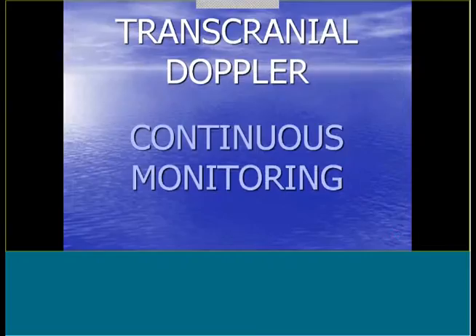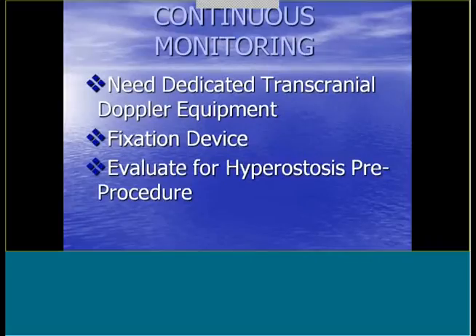Okay, today I'm going to talk about transcranial Doppler continuous monitoring. To do TCD monitoring, you need specific dedicated transcranial Doppler equipment. I know some of you probably have the larger imaging systems, maybe you don't, but just know that they do not have fixation devices. The only companies that have the capability of monitoring are the dedicated companies.